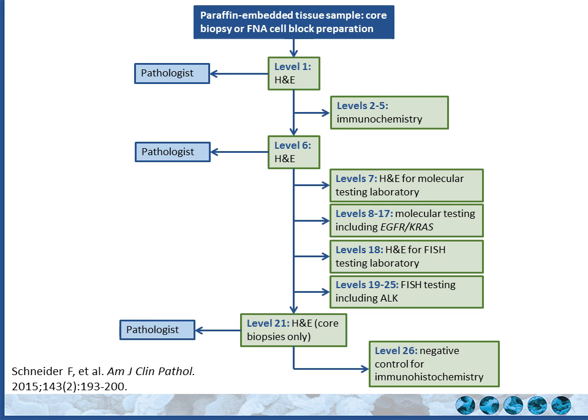Our histology manager, she doesn't like it, but it has actually increased our yield for molecular testing and FISH testing from 75% to 95%. So before we implemented this, we haven't published this data, but anecdotally in our practice, before we implemented this particular method, we would have about 30% of our cases or 25% of our cases, we wouldn't have sufficient tissue to do all the testing. Now, that's about 5% of the time.